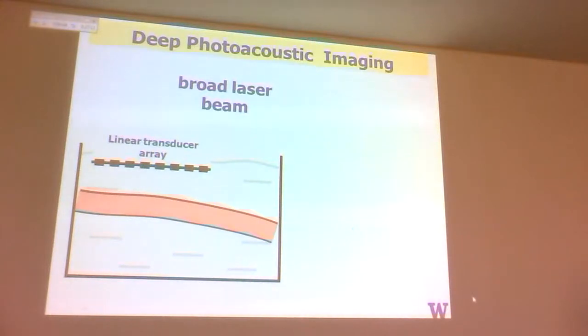So this is an area which we have worked on for a while now. This broad laser illumination which is used now, with a transducer, is great when you're doing this 360, but for real clinical applications you're going to be restricted to these linear arrays, it can be two-dimensional, but they're physically limited apertures with which you're going to be acquiring the data.